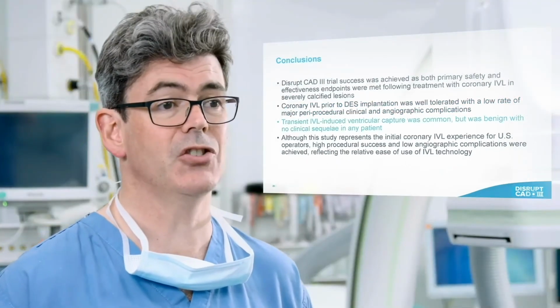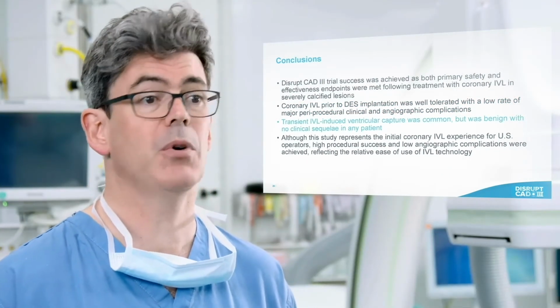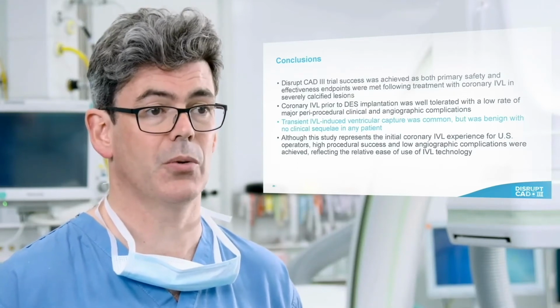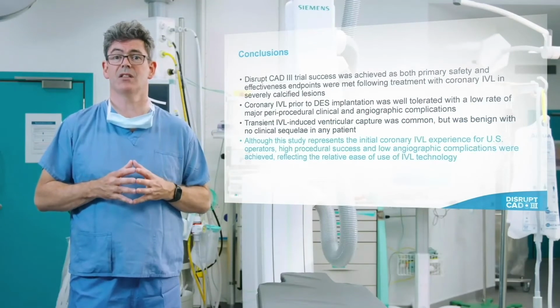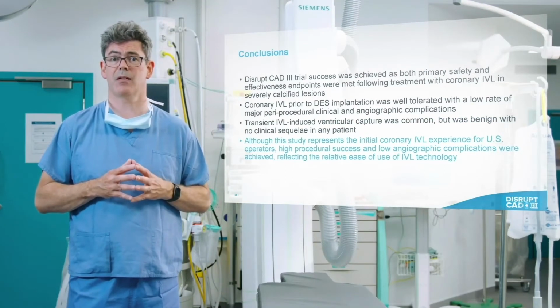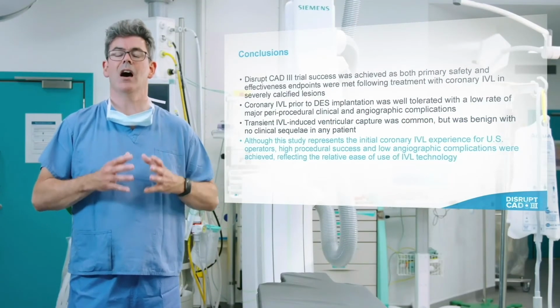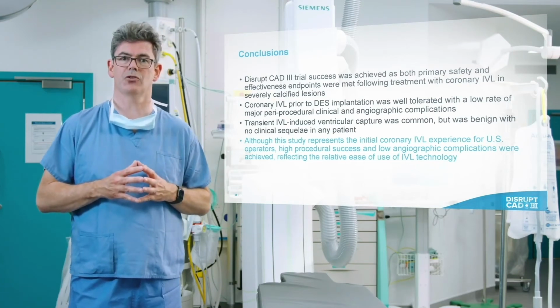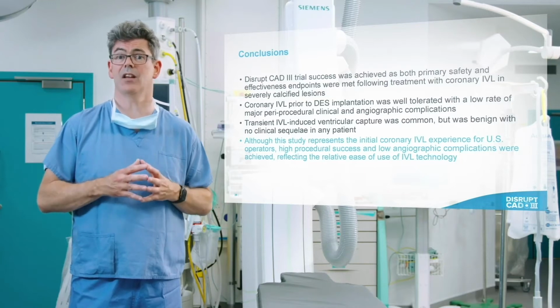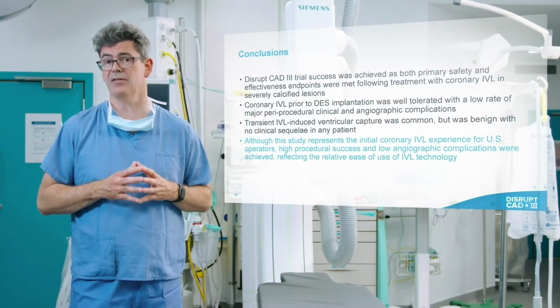Transient IVL-induced ventricular capture was common, but was benign, with no clinical sequelae in any patient. And although this study represents the initial coronary IVL experience for US operators, high procedural success and low angiographic complications were achieved, reflecting the relative ease of use of IVL technology.